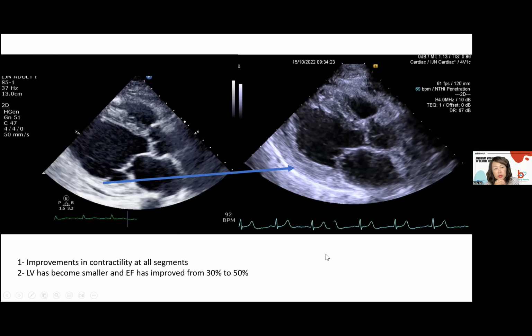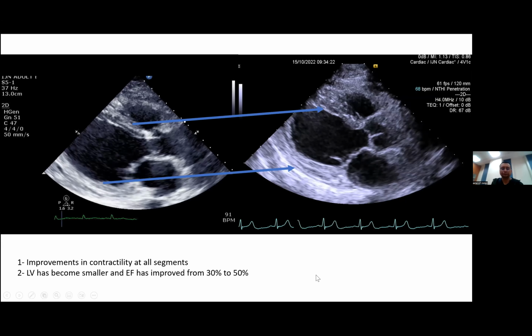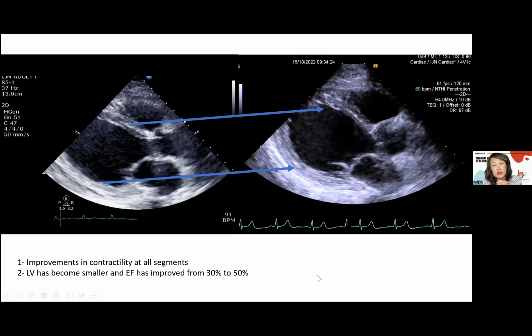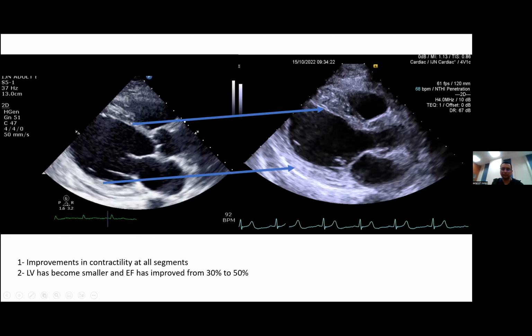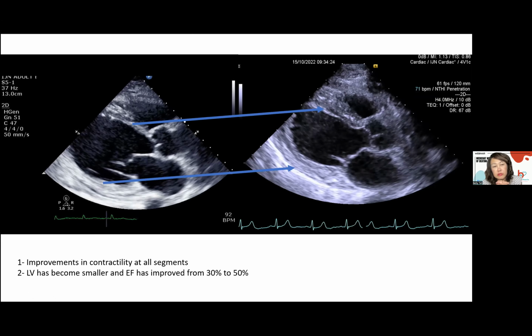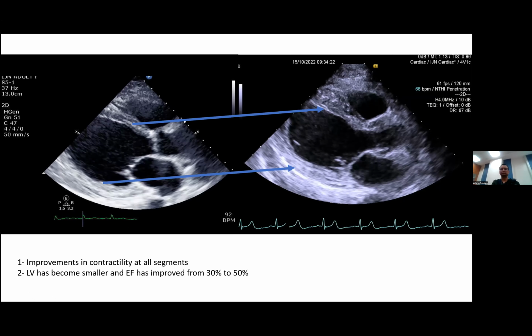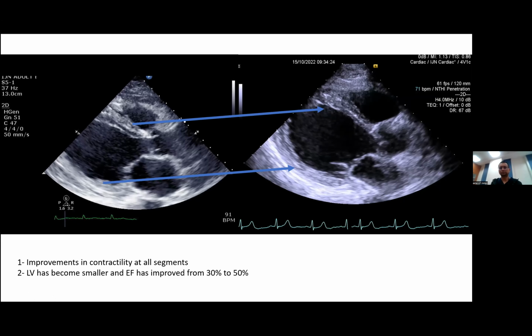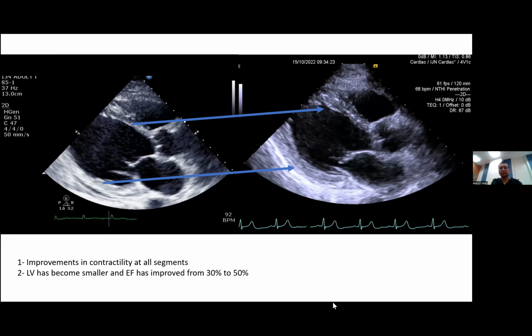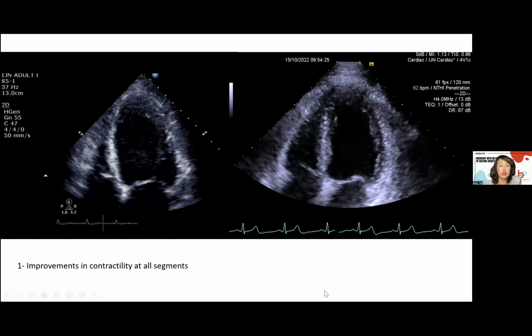I suspect that it will improve even further. Yeah, because the myocardium doesn't look like it has infarcted. That's right. I think as you optimize your heart failure treatment and you have already revascularized 2 vessels, which I think should be adequate, it will improve further. Yep. Okay, continue, Dr. Betty. Yeah, it's very nice. The results are very good.